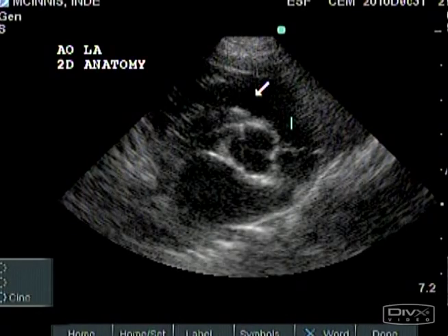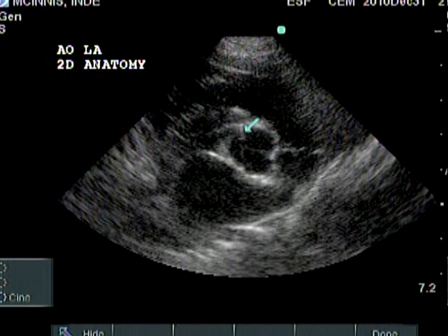The closed aortic valve is the landmark for positioning the M-mode cursor. The right coronary cusp of the aortic valve is in contact with the right ventricle. The left coronary cusp of the aortic valve is in contact with the left atrium. The non-coronary cusp of the aortic valve is in contact with the interatrial septum. To the right of the aortic valve will be the pulmonary valve.